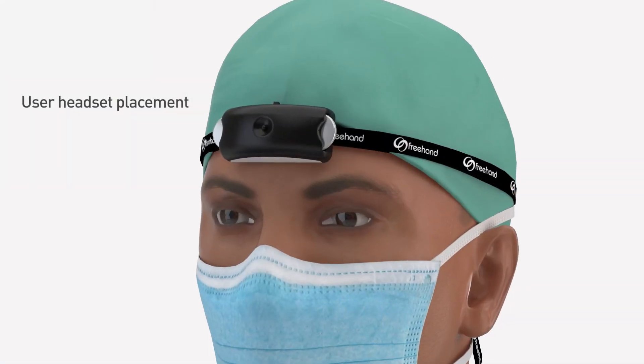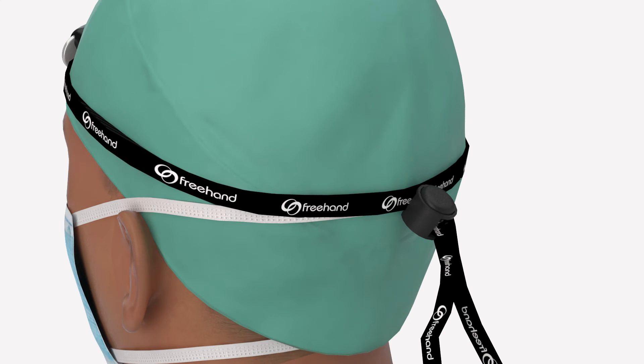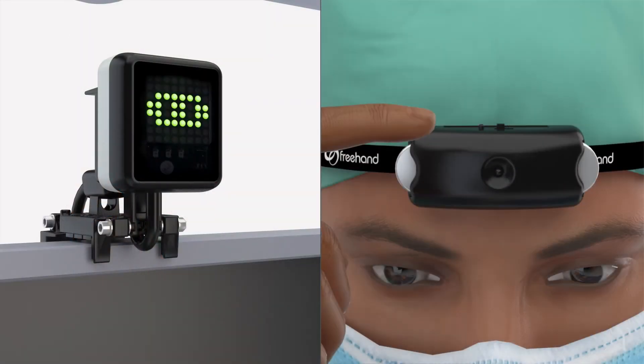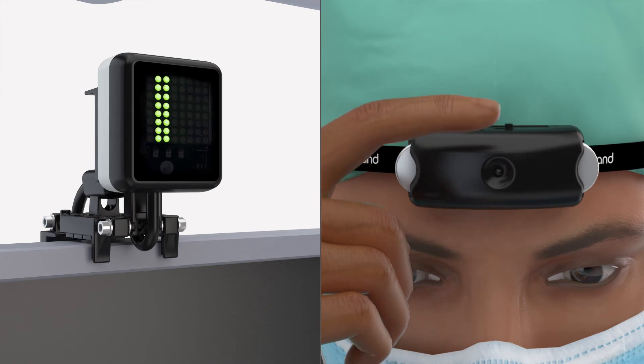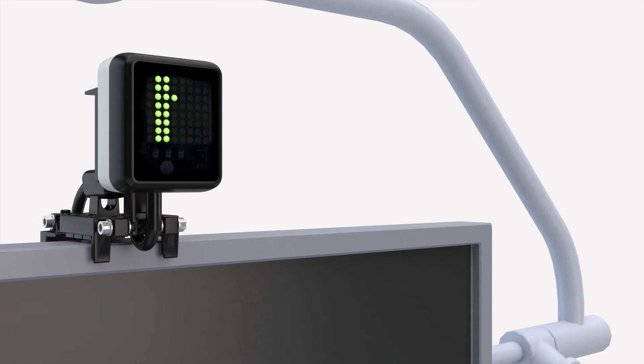The headset should be placed with the switch facing up at the midpoint of the surgeon's head and one finger width above the eyebrow. To secure it in place, tighten the headband using the toggle clamp shown. With the headset now in line with the indicator unit, it should be turned on. Confirmation of pairing is observed with a change in the indicator unit display.